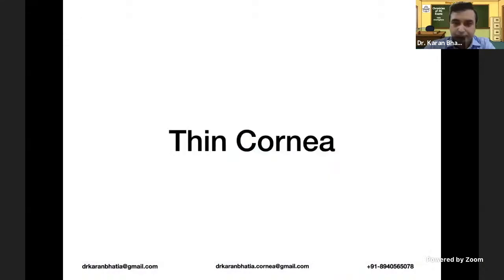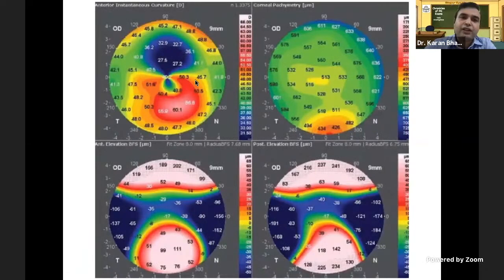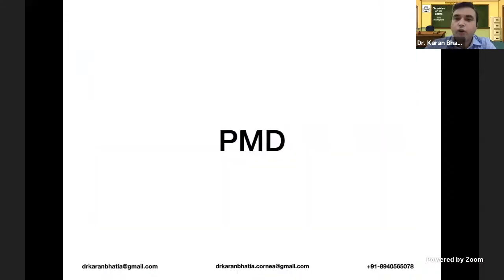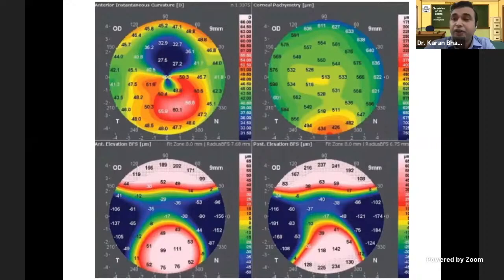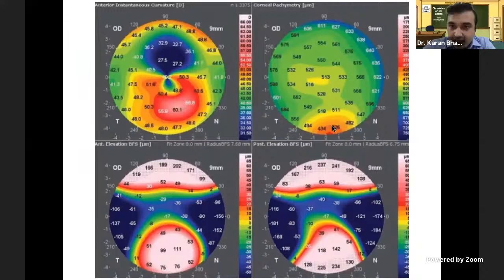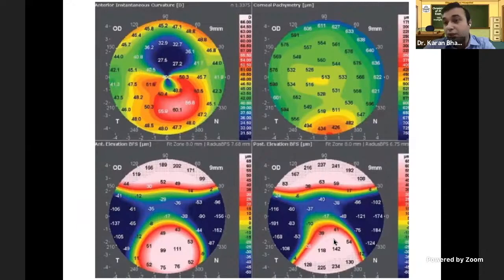This next slide shows a crab claw pattern — suggestive of pellucid marginal degeneration (PMD). An important point to differentiate PMD from keratoconus: in keratoconus, the area of thinning and the area of elevation coincide. In PMD, the area of thinning is inferior, but the elevation is above it — the curvature steepening is above the zone of thinning. This dissociation between thinning and elevation distinguishes pellucid marginal degeneration from keratoconus.